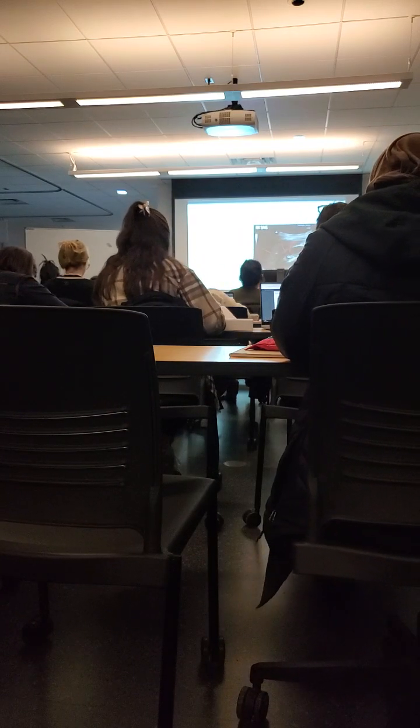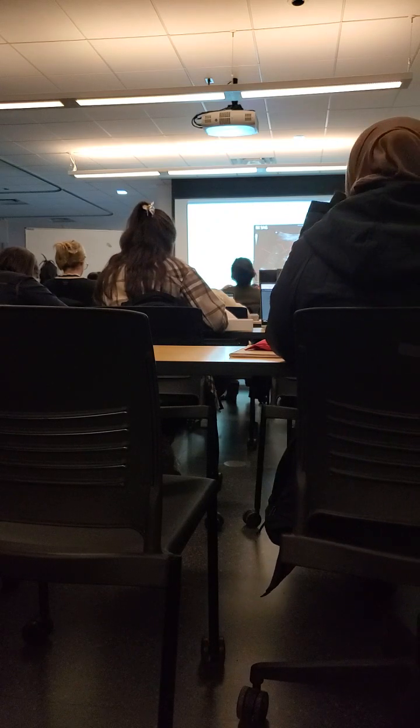Okay, here's your measurements. See how they're just going into that section there. So the cortex should be hypoechoic to the other structures in the kidney. The medulla and the pyramids are going to be anechoic. There's a pyramid. And then the sinus is going to be hyperechoic, because there's a lot of fat and things in there.